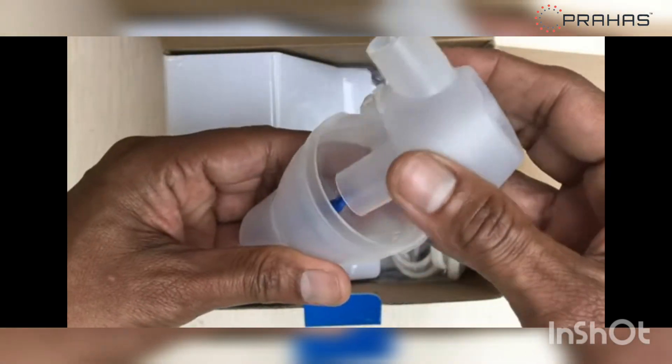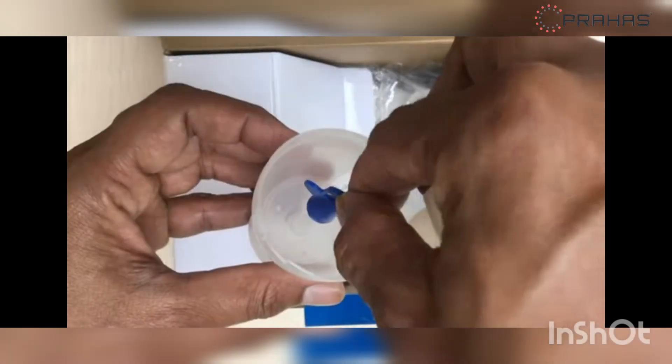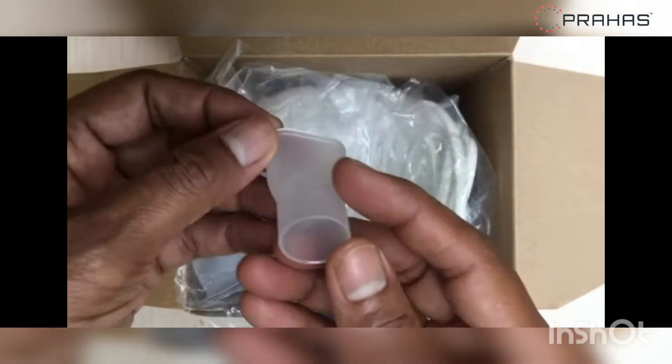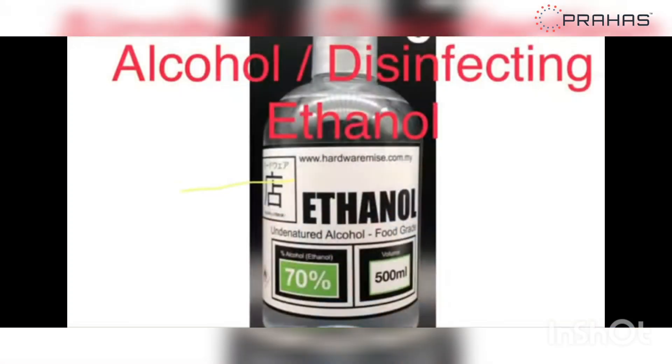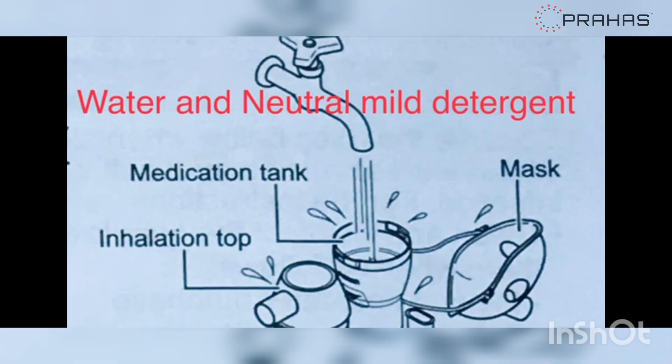The parts like the inhalation top, vaporizer head, medication tank, mouthpiece and the mask can be cleaned using commercially available disinfectant or simply using warm water and neutral mild detergent.